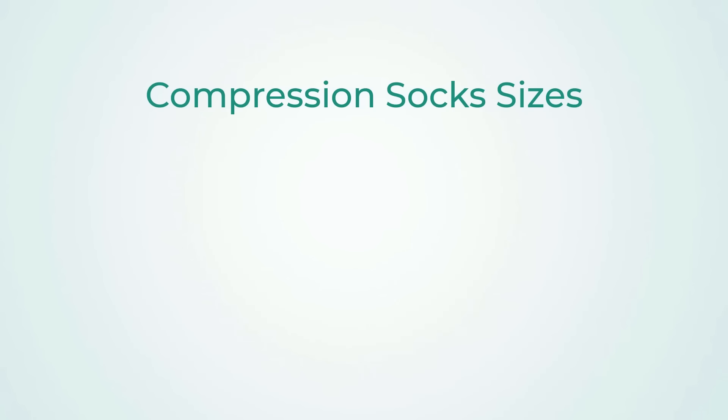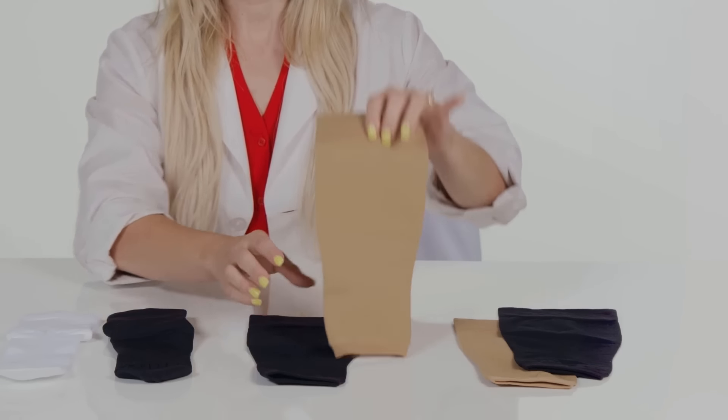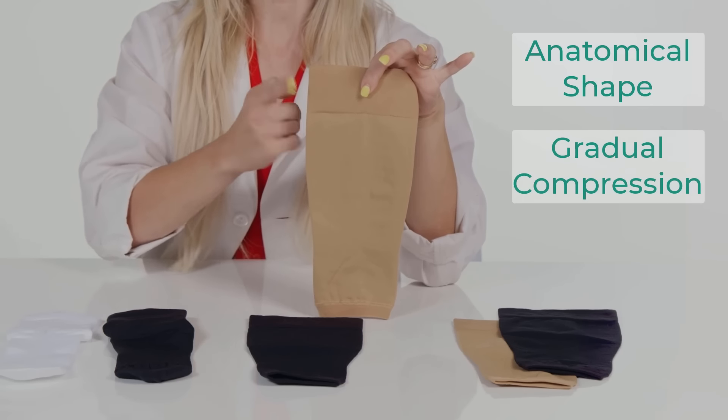The socks are available in 15-20 and 20-30 compression levels. They are available in four sizes: small, medium, large, and extra large, and in a variety of colors. The calf sleeve has a unique anatomical shape with a gradual compression that starts at the ankle all the way up to the knee.